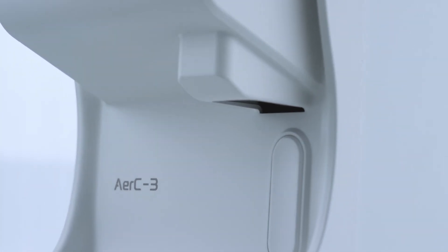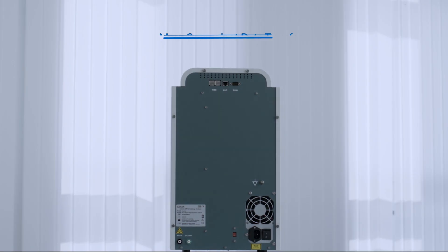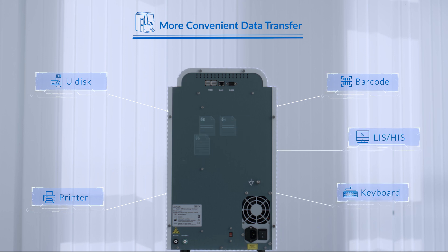With multiple interfaces designed, AirC3 enables data transmission and software upgrading more easily and user-friendly. U-disc for data transmission and software upgrade, as well as keyboard and mouse interface and external printers, which is more convenient for terminal use.